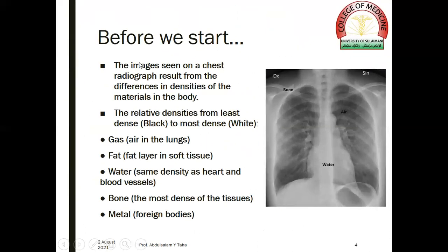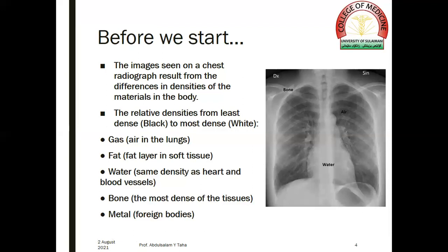Before we start, the images seen on a chest radiograph result from the differences in densities of the materials in the body. The relative densities range from least dense, or black, to most dense, or white, in the following order: gas — that is, air in the lungs — is the most radiolucent and appears as a black shadow, followed by fat, then water, which has the same density as heart and blood vessels, then bone, and finally metal foreign bodies, which are the most dense.